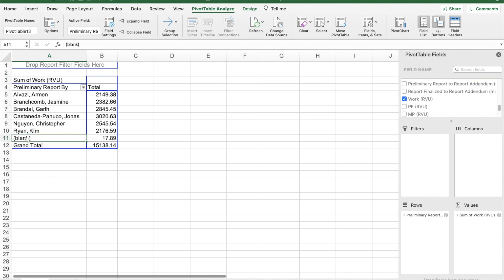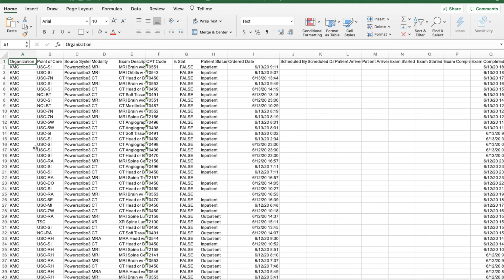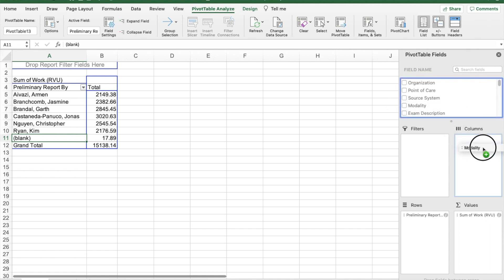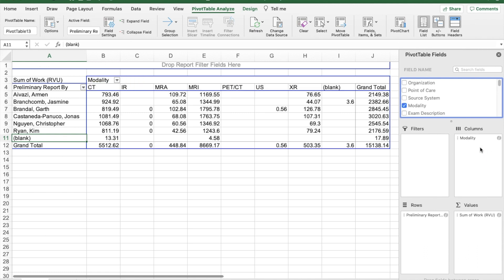As you can see, there's a blank column here. Sometimes when you pull data from mPower, there are some blank spaces, so you can go ahead and delete those and refresh your pivot table. There are also other interesting things you can do — for example, if you want to break things down by modality, drag modality into columns. Now you can see the number of RVUs read broken down by different modalities.